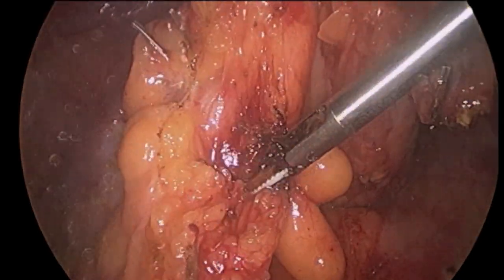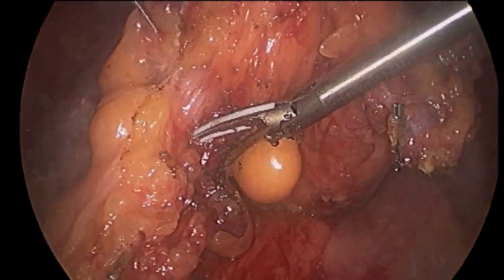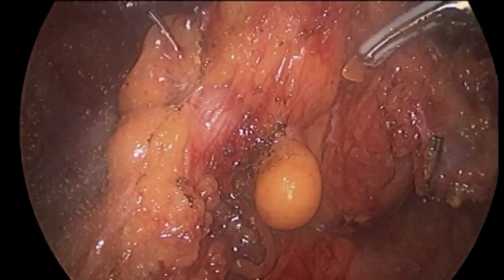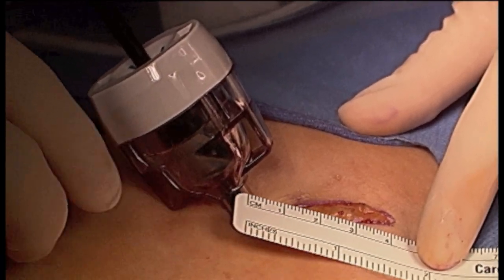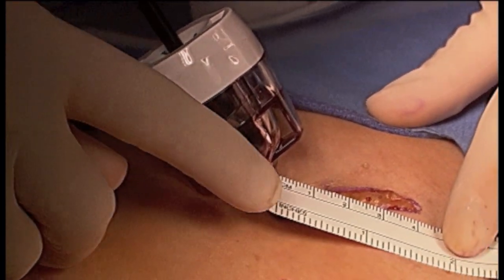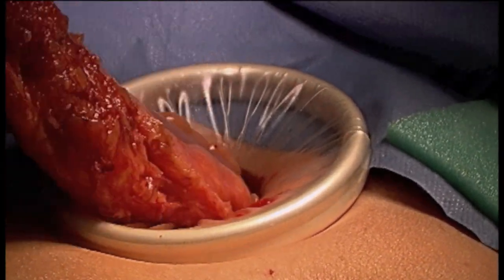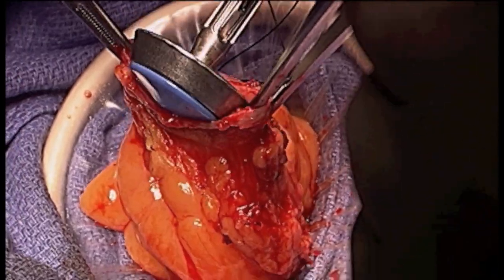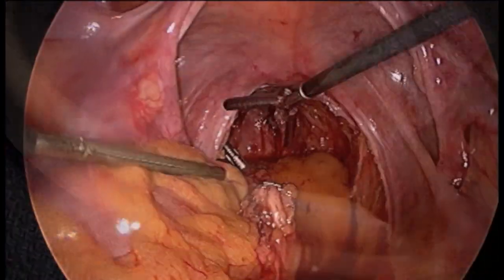In order to remove the tumor and the surrounding rectal tissues, the left lower quadrant laparoscopic incision is extended to 4 centimeters. A wound protection sleeve is then inserted to prevent any tumor cells from being implanted into the wound when the cancer is pulled out of the abdomen. The rectal portion to be removed is then extracted, the bowel divided, and the specimen sent to the pathologist to examine the tumor and nearby lymph nodes under the microscope.